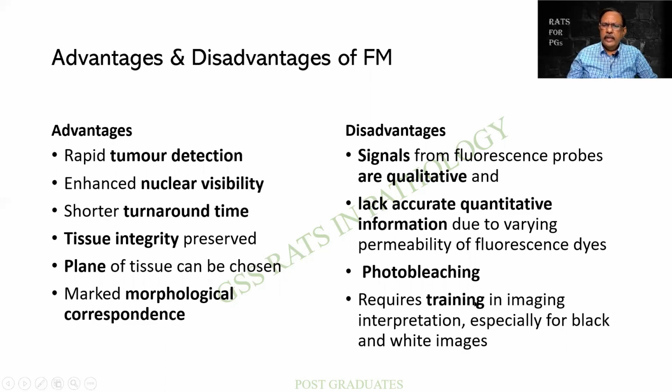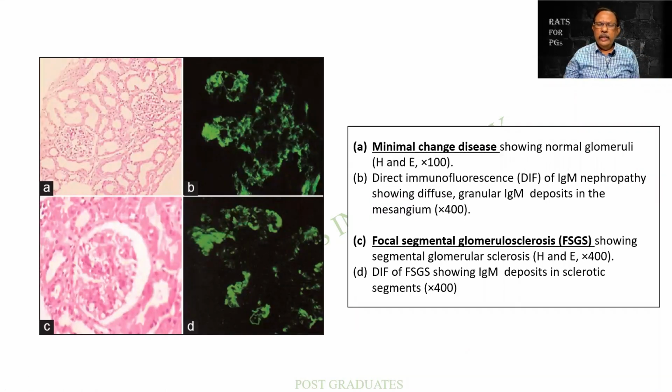And it requires trained personnel who can handle the equipment, interpret, and who will also know the black and white images of it. So this is the list of advantages and disadvantages which we shall be having at the corner of our mind as we progress with the class for today. As I told you earlier, this is a technical class, and in a technical class I give more emphasis to the utility and the general applications.